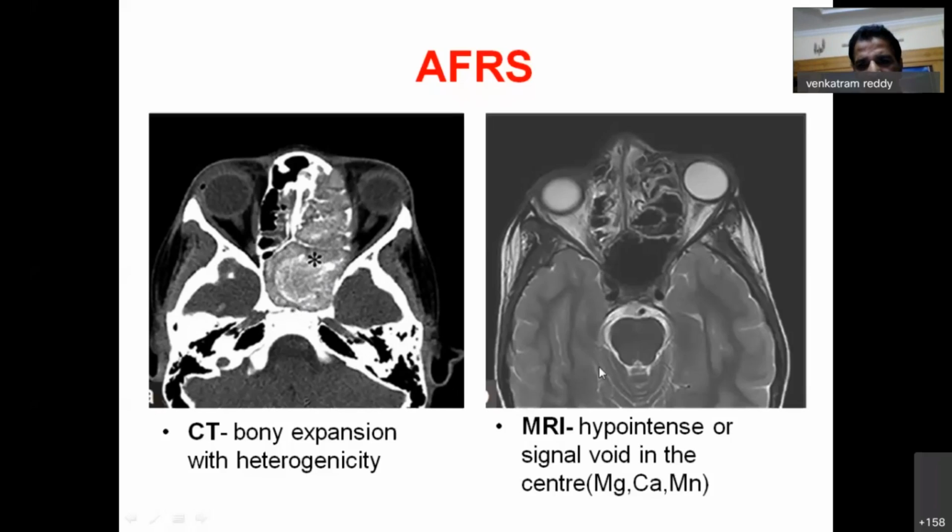So if you take MRI, again, MRI is very characteristic compared to the CT scan contrast.